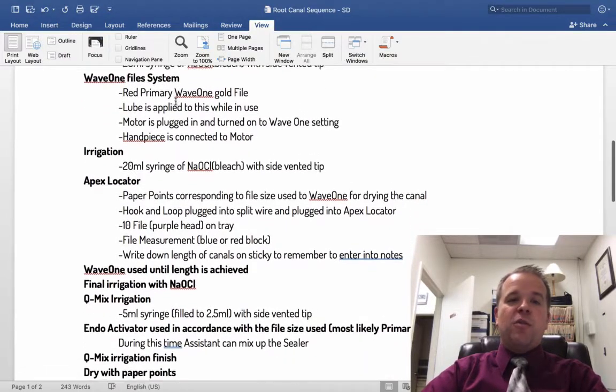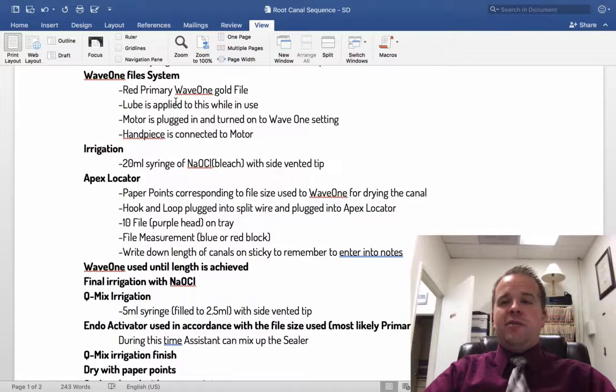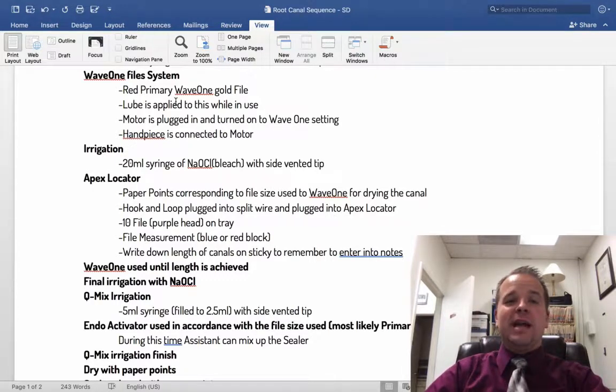Then you'll go to the wave 1 file. Dentists might use a Gates Glidden, might use a lot of different things to open up the canals just a little bit more, and this is really dentist specific. This isn't something that every dentist does the same, that's for sure, but they generally follow the 3 rules. You'll have the access opening, and then you're going to be able to clean out the files.